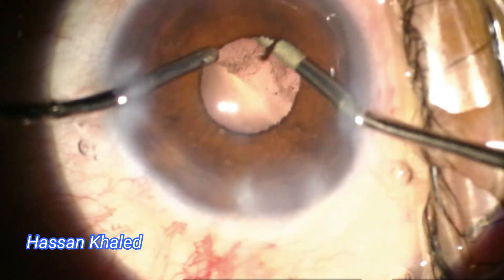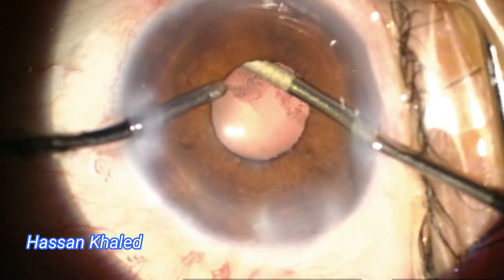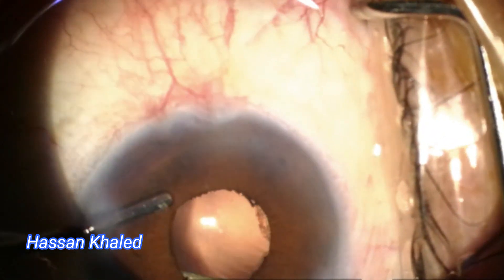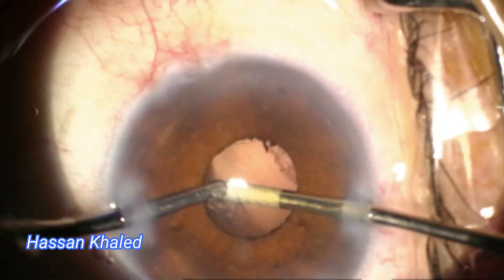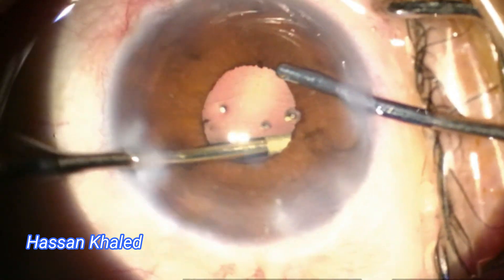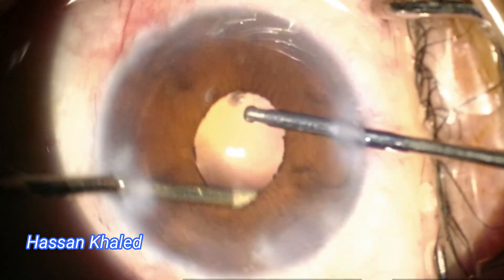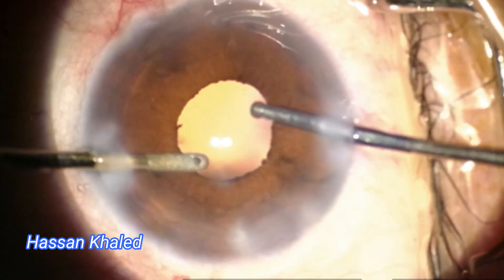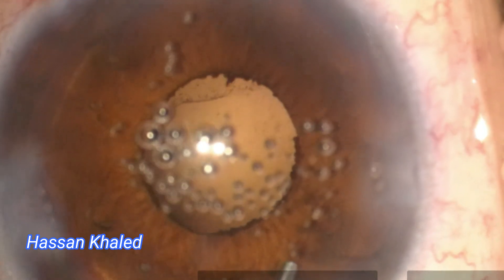Now it's time for cortical removal using bimanual irrigation and aspiration. Removing the cortex through a small pupil is not easy — we have to be careful. I tried to inject intracameral mydriatic agent, but unfortunately the pupil, as we can see, does not respond.